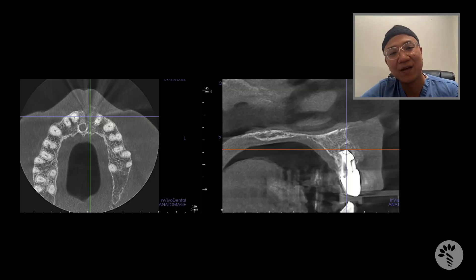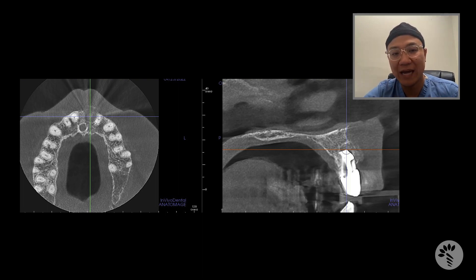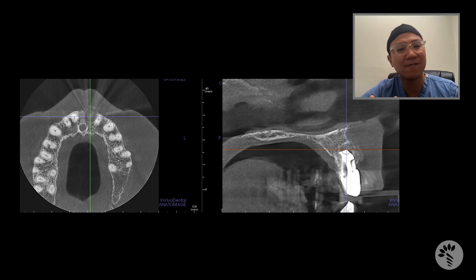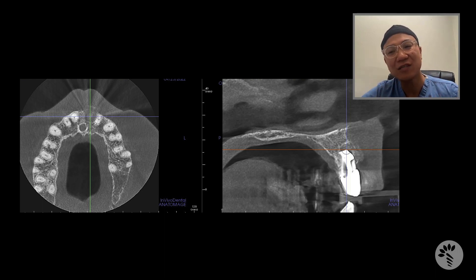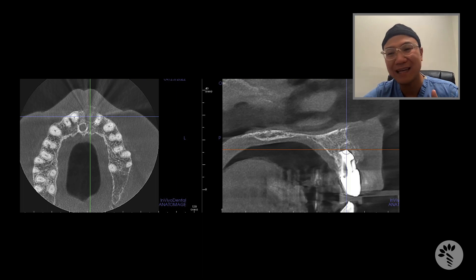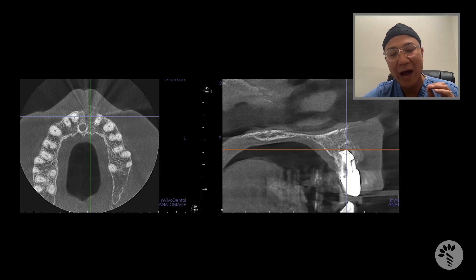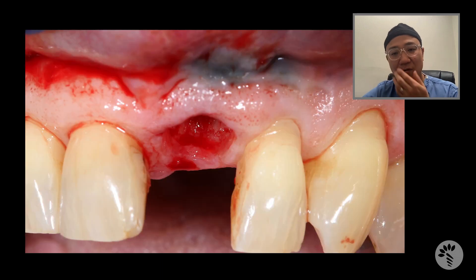Look at the CT scan here. You can clearly see there is complete missing of the buccal plate, and the radiolucency — the size of the radiolucency is much bigger than the tooth — which means there is a lot of infection and granulation tissue around this tooth. And look at the sagittal view, where the buccal plate is completely missing. This is not the case where you can just do extraction and bone graft without raising a flap and leave this area open. You have to do conventional flapping with conventional guided bone regeneration.